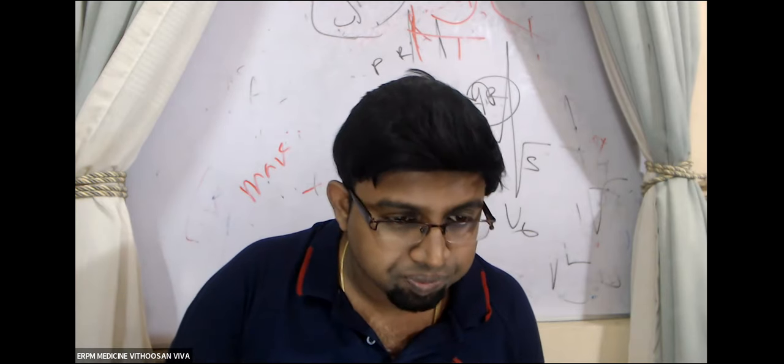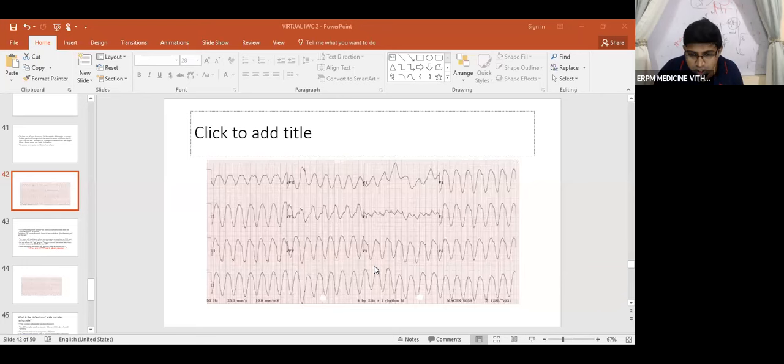So look here. What about here? All are negative, isn't it? So you don't see the transition, the negative to positive transition.